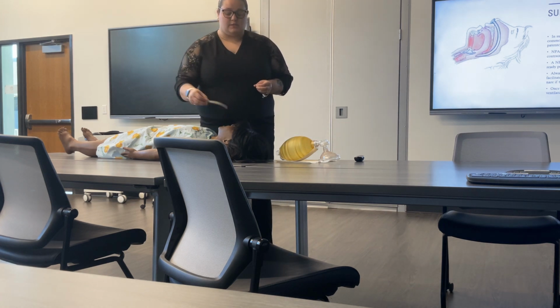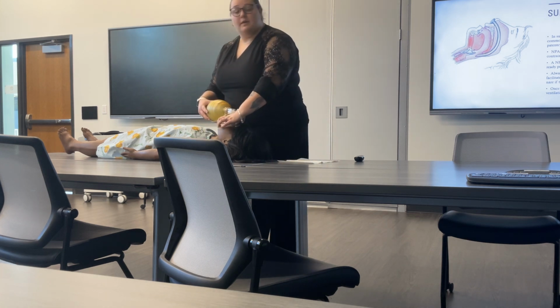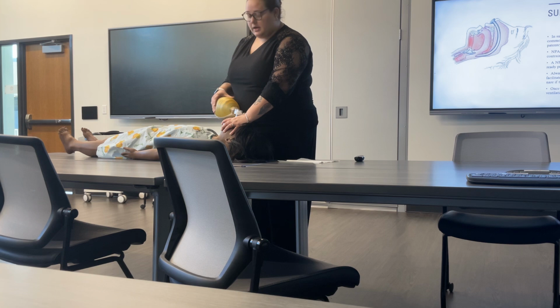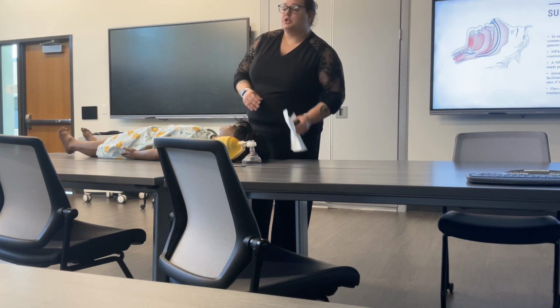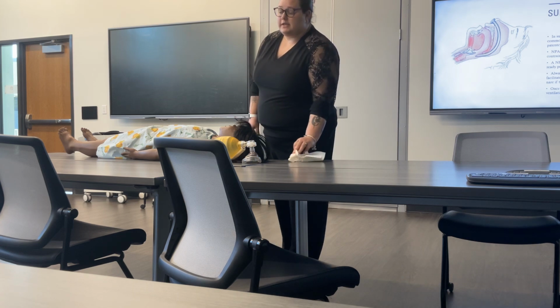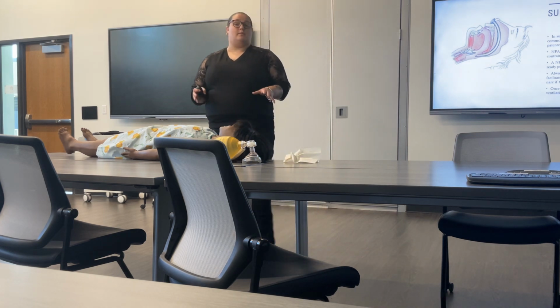If you meet resistance with both naris, you need to remove it and maybe consider going ahead and doing BVM ventilations until you're able to figure out your next method for securing an airway, whether that be an OPA if the patient does not have a gag reflex, or should I consider aggressive management with ET management, or should I do a surgical airway, depending on what's wrong with my patient.